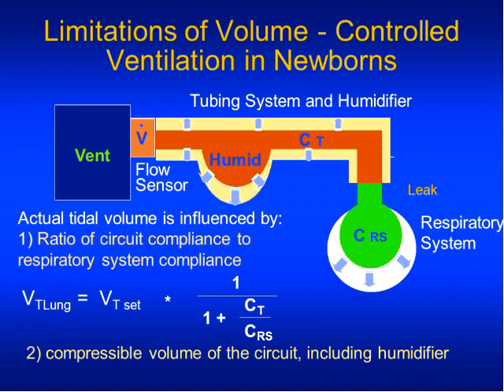Up to a point you can compensate for this, even though it turns out that even under the best of circumstances, you usually have to set a tidal volume of something like 15 mLs back at the machine to get an actual delivered tidal volume to the baby of about 5 ml per kilo. The problem is the leak around the endotracheal tube, which now becomes a wild card. That leak tends to be highly variable and not easily compensated for. So even the ventilators that have compliance compensation and all of that, that all breaks down when you have a significant leak around the endotracheal tube. So that is the challenge.